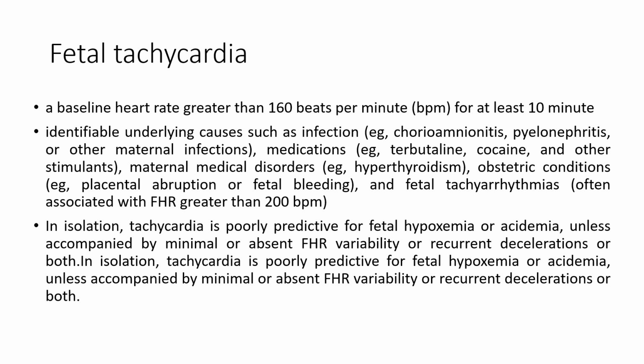When we see fetal tachycardia, we should think about what's the cause of the fetal tachycardia. If it's an infection, we treat the infection. If we treat the infection, most probably the tracing will revert into a normal baseline, and you will see the fetal heart rate going from 160 or 170 down into 140 and 150. Right?